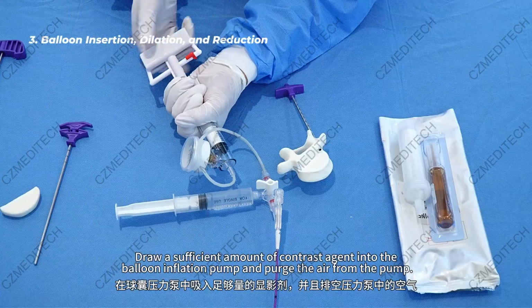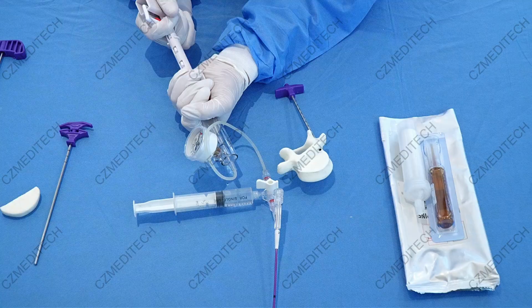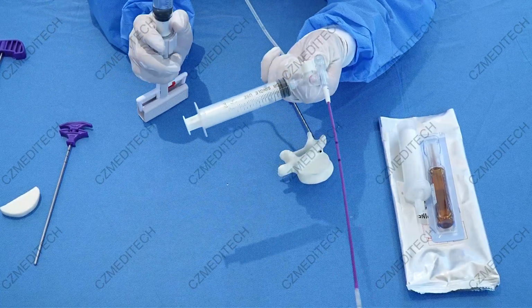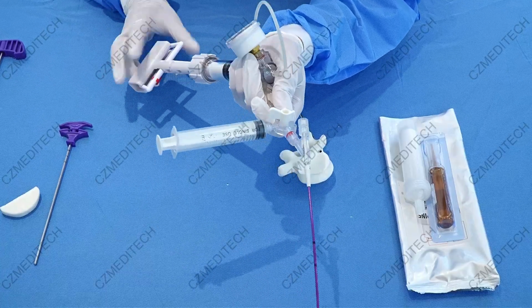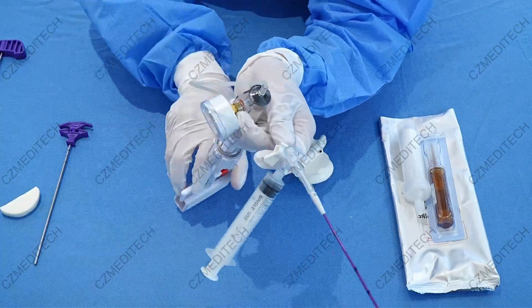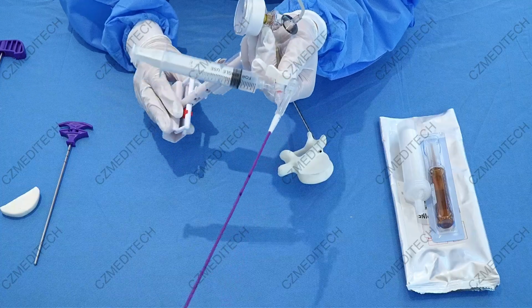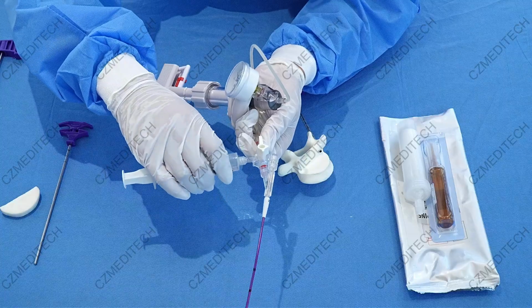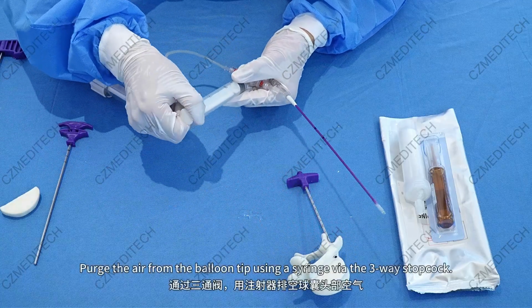Draw a sufficient amount of contrast agent into the balloon inflation pump and purge the air from the pump. Purge the air from the balloon tip using a syringe via the three-way stopcock.